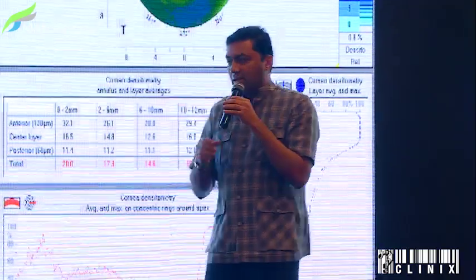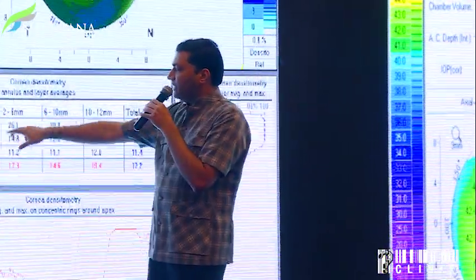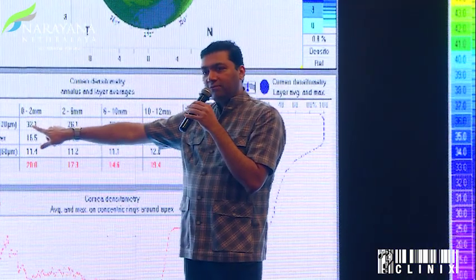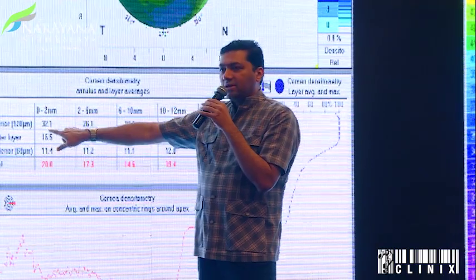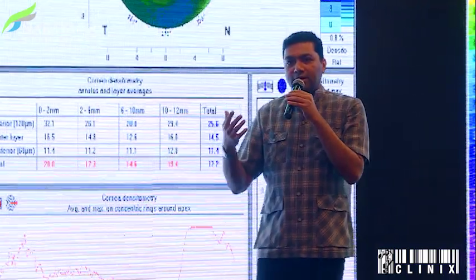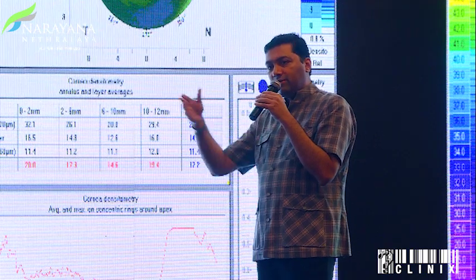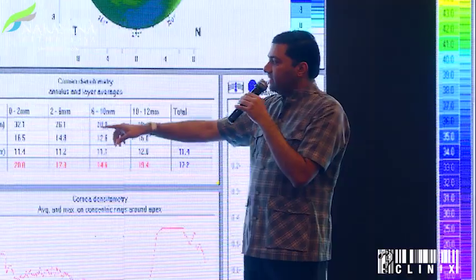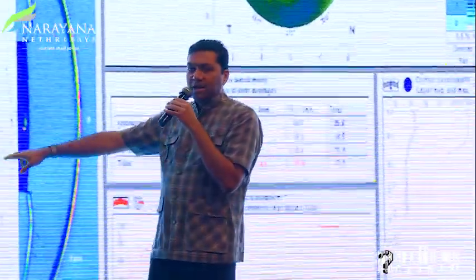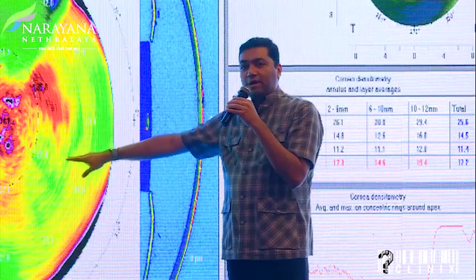For example, if you're done with cross-linking and your densitometry when you did the cross-linking was around 15, now it's 32. When you measure at 32, the machine's repeatability really goes down, and we published this in the Indian Journal of Ophthalmology. It takes around 9 months, sometimes 12 or 13 months, for this to reduce.